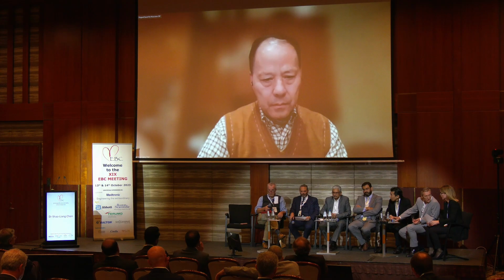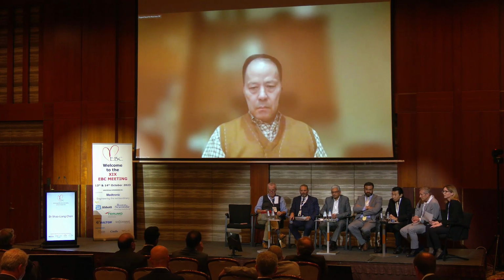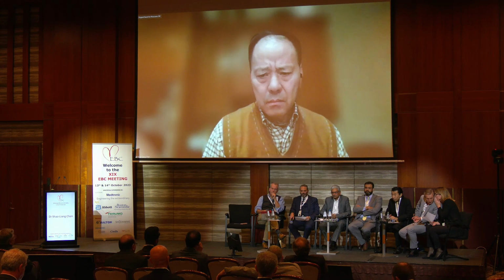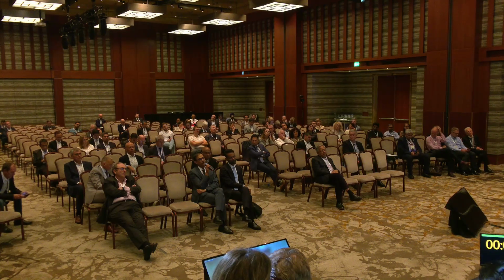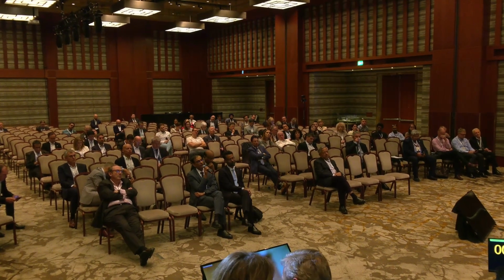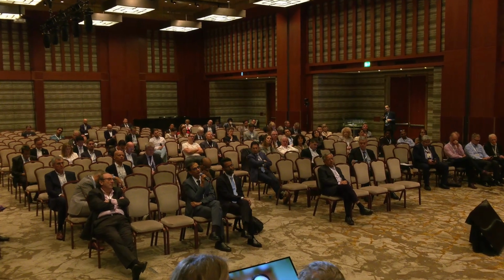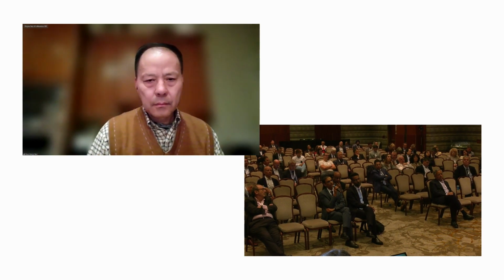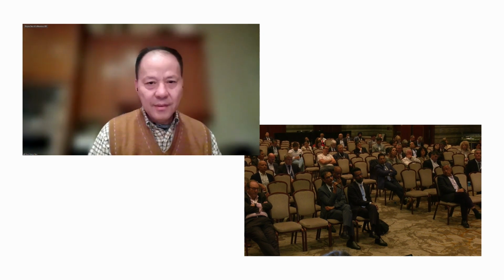Great question from the floor. One question, Dr. Chen. You said that the side branch lesion length should be less than 10 millimeters before we include them in the study. But in the case that you showed, the drug-coated balloon looked much longer, almost 30 millimeters in length. And after that, we used a short balloon to do a kissing balloon dilatation. Don't you think that would influence the way we treat the side branch? Because we're putting in a long balloon and then inside that a short balloon in a dissected segment. After all, a balloon is a controlled dissection. So is there some subgroup in which you're going to look at the length of the DCB that we use in the side branch?